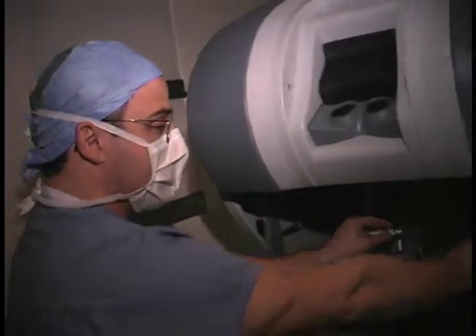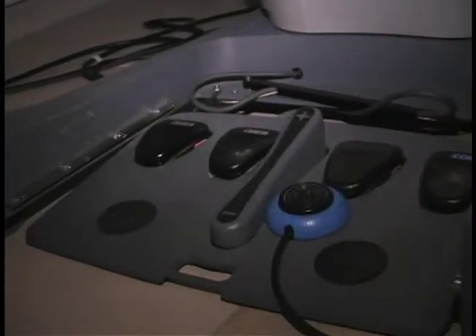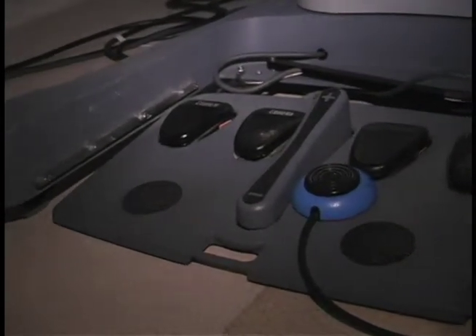Only instead of conventional laparoscopic instruments, we use a da Vinci robotic system. I use hand controls and foot controls to move the camera and move the instruments. There's a clutch, camera pedal, and I also use two pedals to control the coagulation if we need to control bleeding or dissect tissue planes.